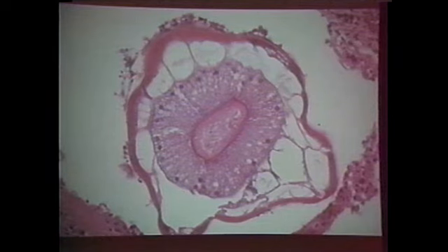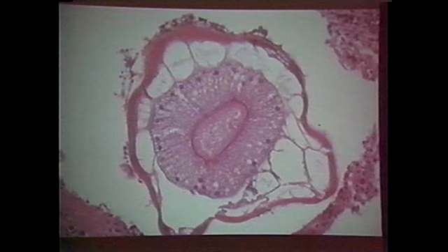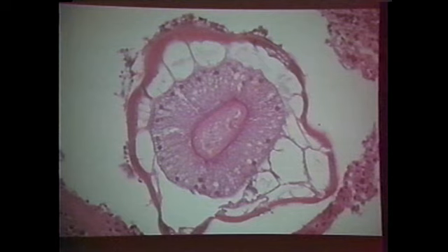There's only one problem. There's three different groups of strongyles. You have your true strongyles, hookworms. You have your trichostrongyles, and you have your metastrongyles. And we'll find, for some reason, metastrongyles have coelomyarian muscles, where the other two groups have flat. I mean, if I was designing them, I'd have all flat muscle. But anyway, this is a characteristic intestine of a strongyle, and it is described as being large and composed of few multinucleated cells. All three groups have this.